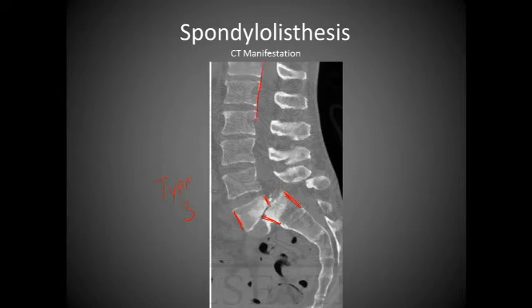The thing to notice is that we have the spinal cord residing in this area here. And the spinal cord has to make this abrupt shift to go down. And you can imagine the type of tension and pressure that this puts on the spinal cord. And so, very, very difficult here to really see that this patient doesn't have severe neurological deficits.